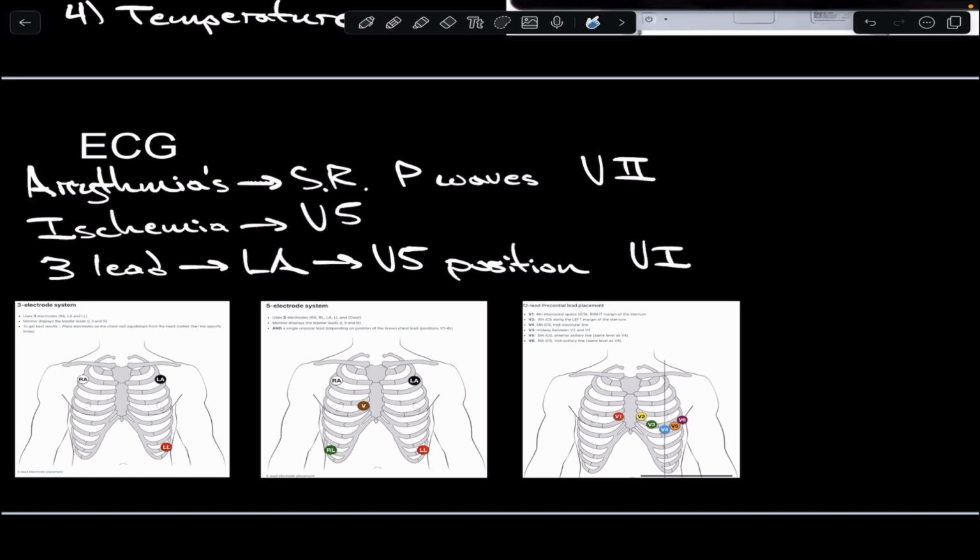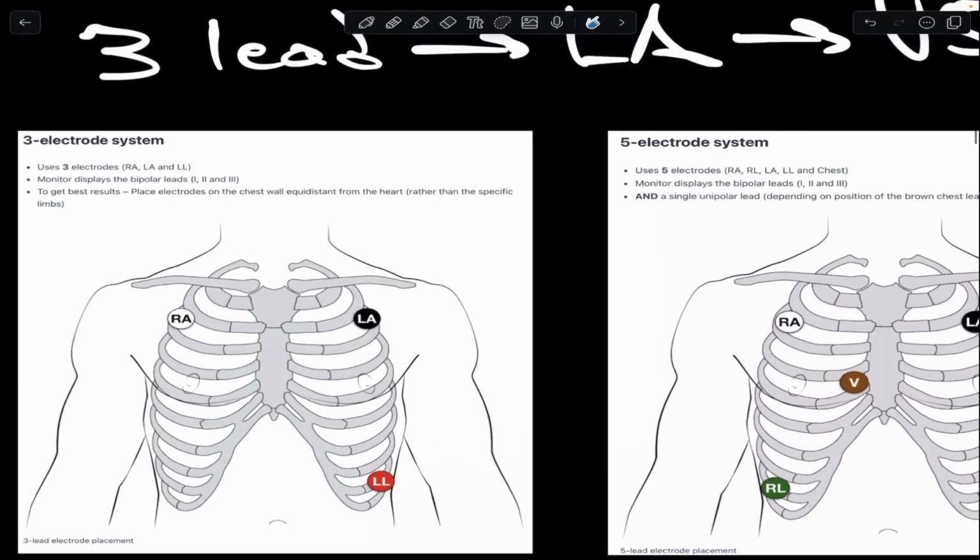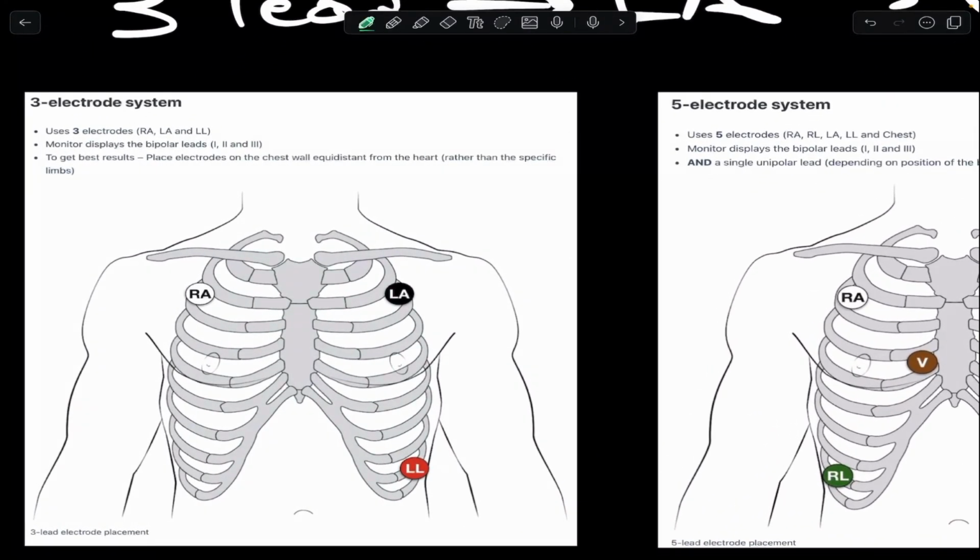So to excel in the OR, in the PACU, at USD on your away rotations, it's going to be very important that you know and you're confident where to place the electrodes of an ECG. That's something that you can very easily do to participate in the care of a patient, to stand out in the OR. It's universally an option because the ASA standards require ECG monitoring for all anesthetic cases.